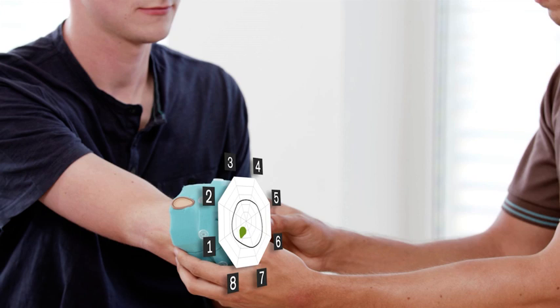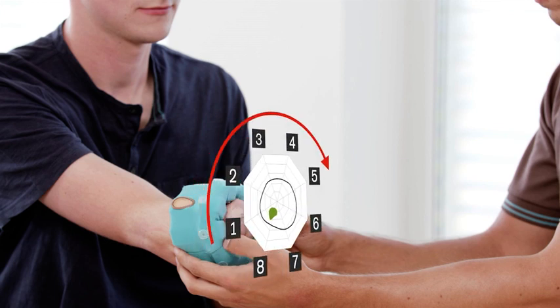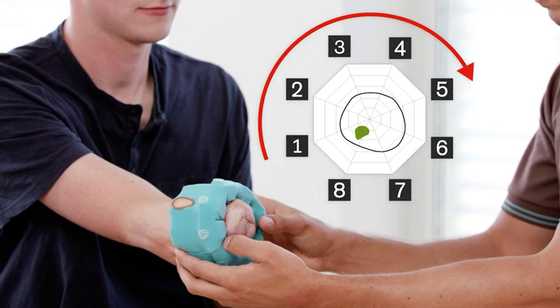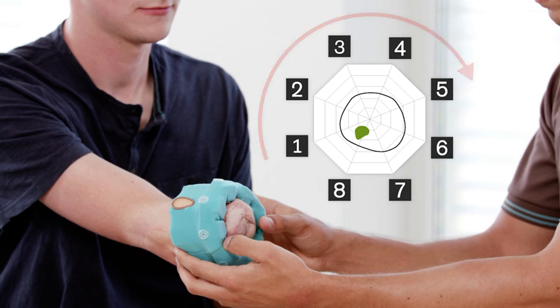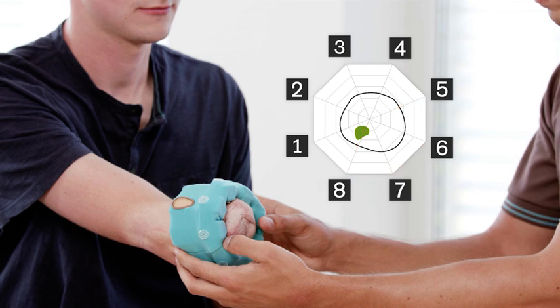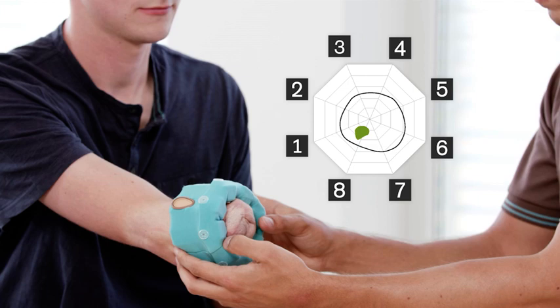Electrode 1 must be positioned laterally, so that the electrode number increases in the medial direction. As a result, the extensor muscles lie between electrode number 1 and 4 and the flexor muscles between electrode 5 and 8, regardless of whether the cuff is applied to a left or right forearm. If the Myo Cuff is always positioned this way, a comparison of the movement patterns from training to training or between different users is possible.